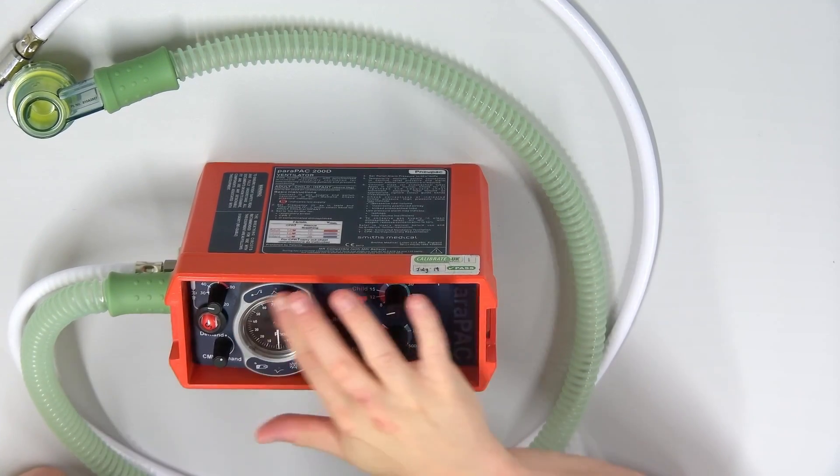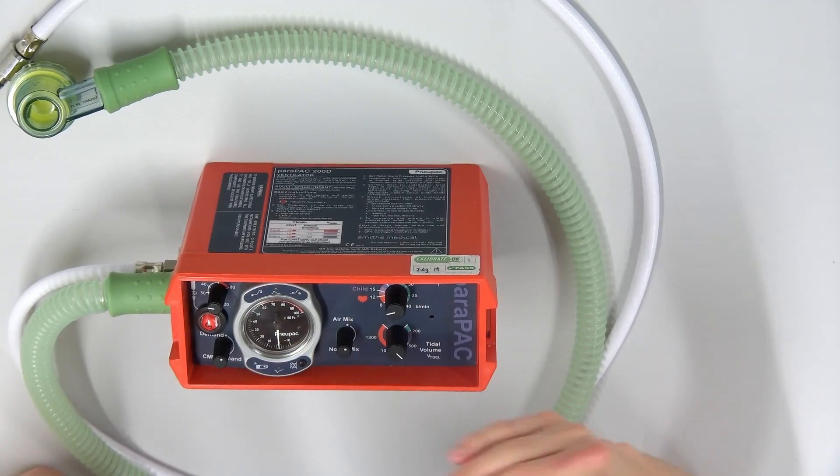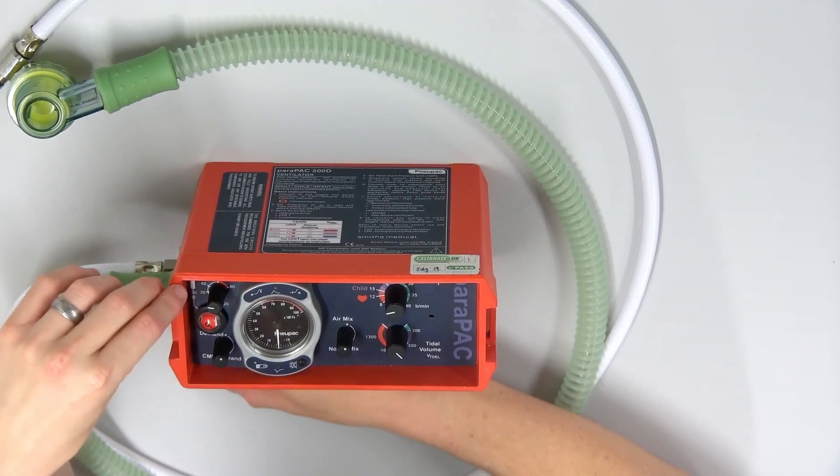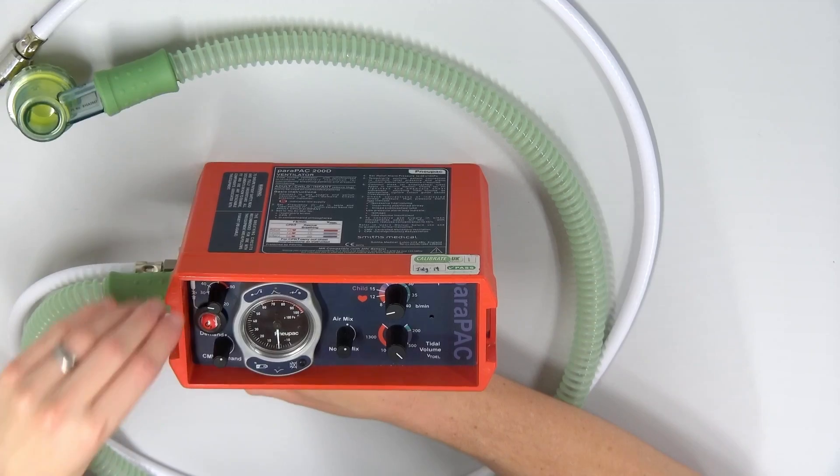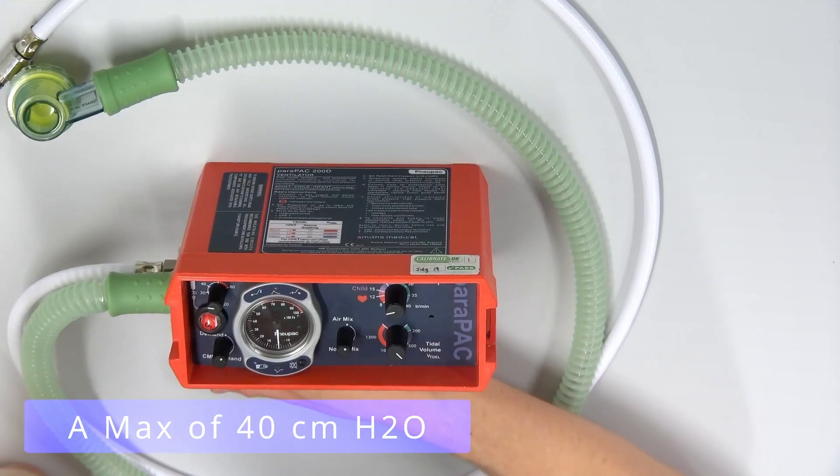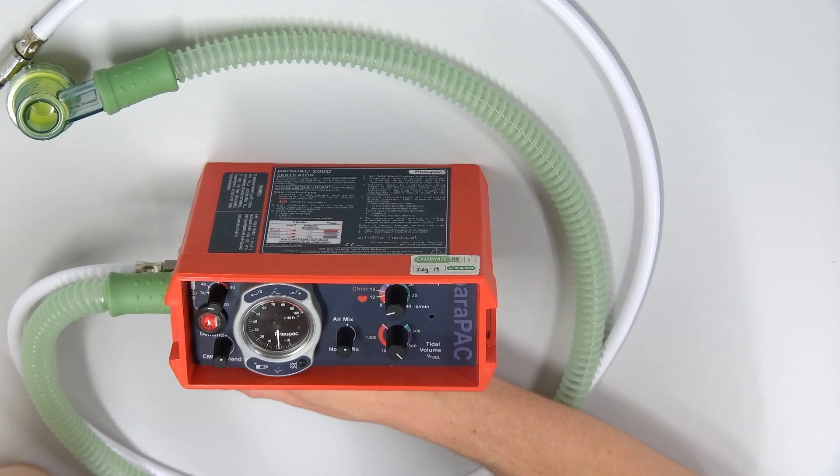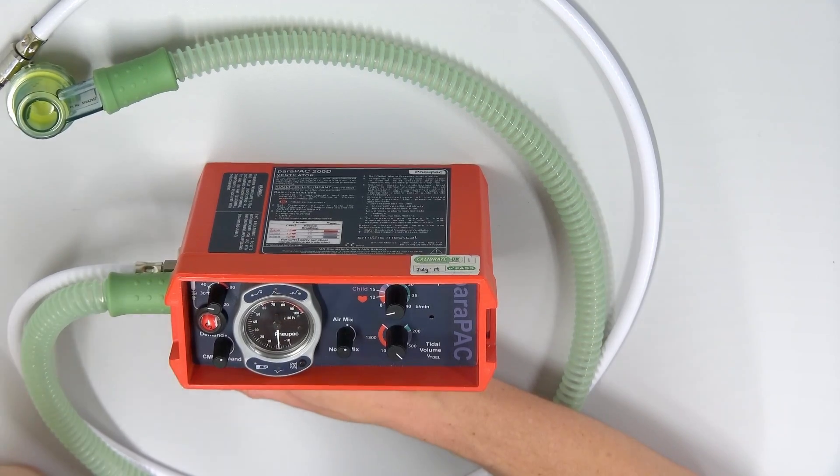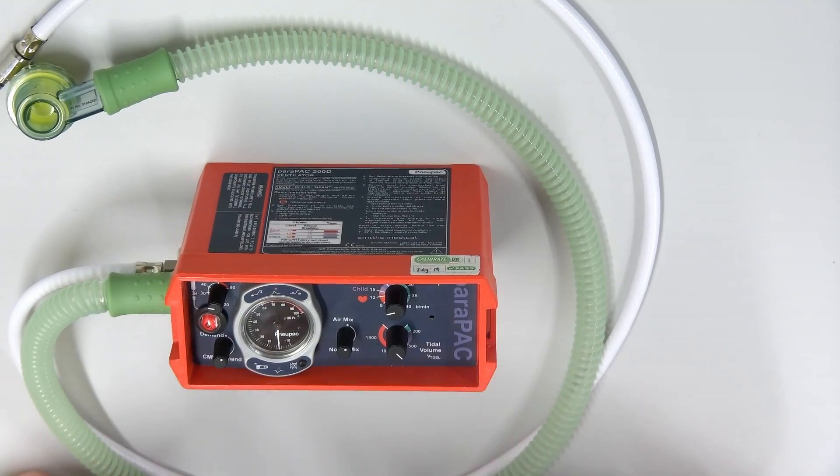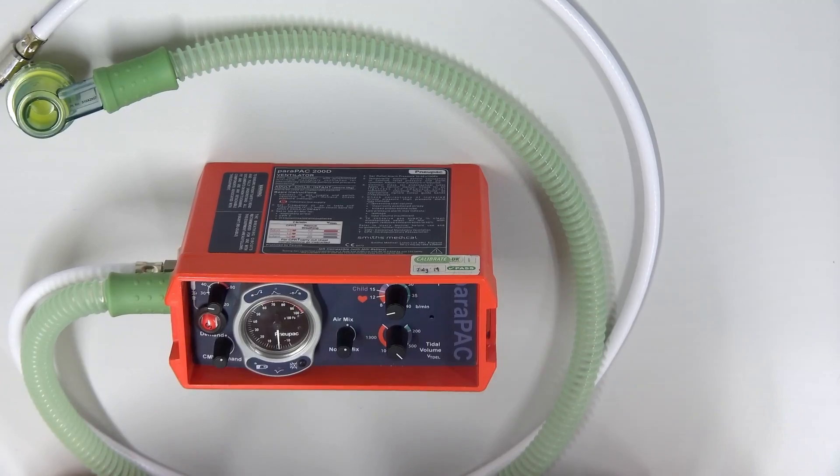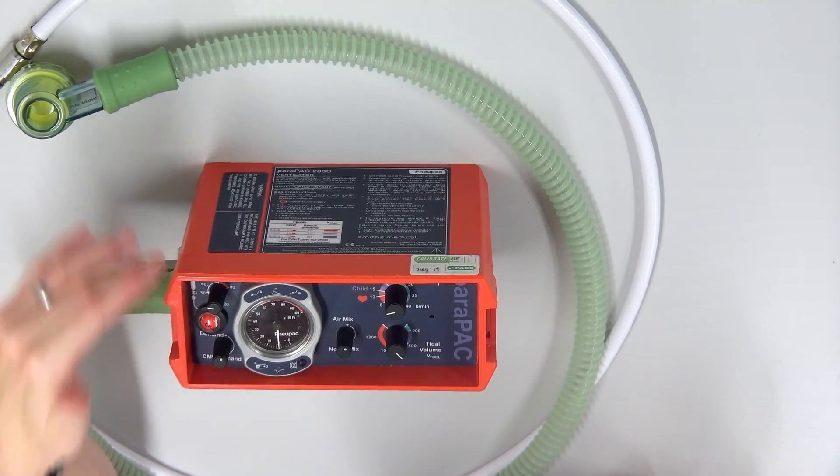This is your pressure gauge. It tells you how much pressure is being administered. On the top left here, we have a relief pressure or an alarm pressure. This can be set to 35 plus minus a bit. Different textbooks will say different pressures. What's important is that we don't give too much pressure, and some patients require more pressure, and so we don't really want pressures to go more than 35, 40.